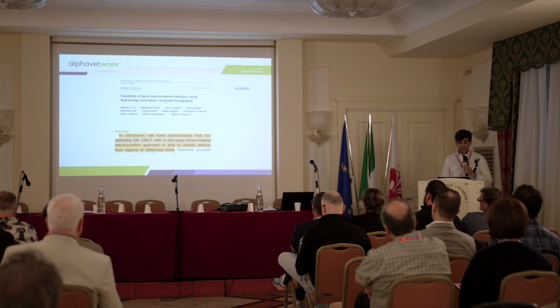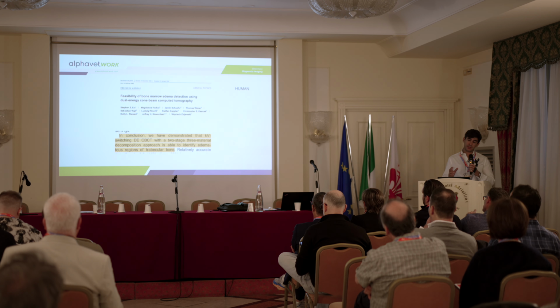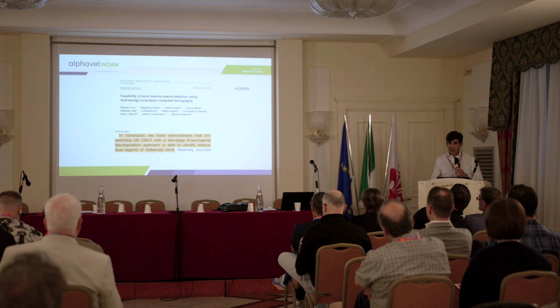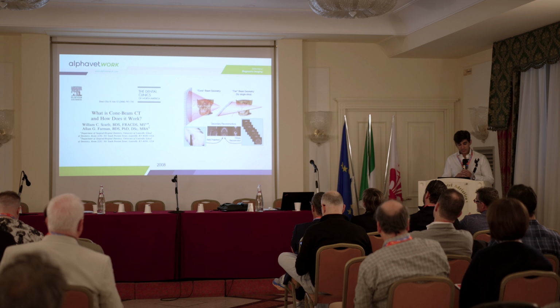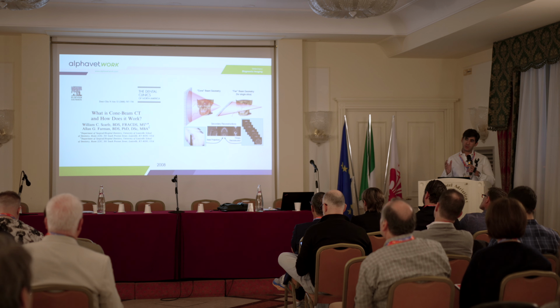In human medicine, there is the feasibility of detecting bone marrow edema using dual energy cone beam CT. This is something that we like a lot for orthopedics, because also in MRI the bone marrow edema is mostly seen for the femur and the femoral condyles. We don't have the clinical impact of that in veterinary medicine, but in humans we know that bone marrow edema provides pain. In humans, in 2008, they were describing how it works and what they're doing. So we can see that we are like 20 years behind, and we are still talking about the teeth.